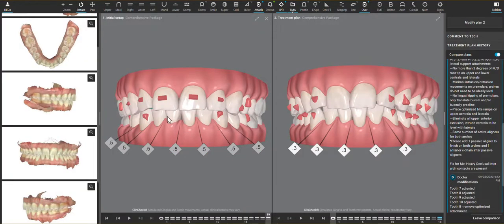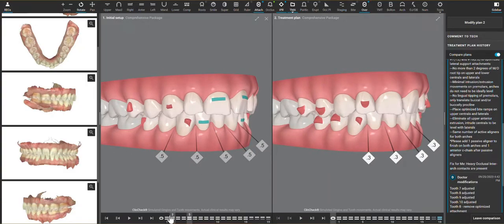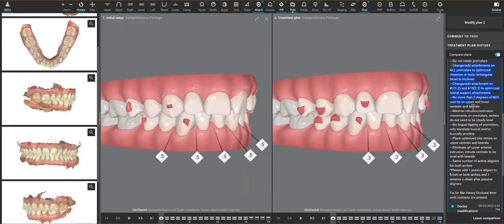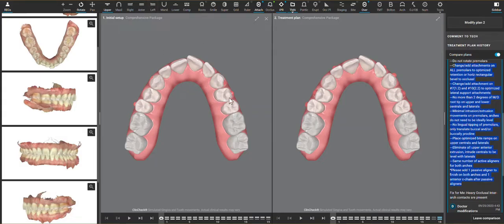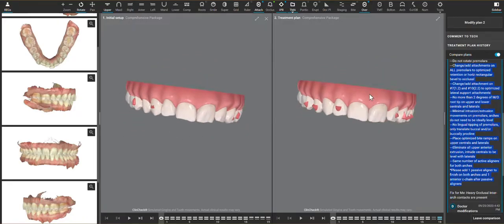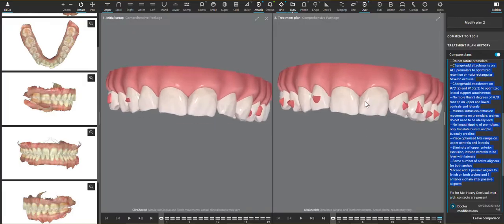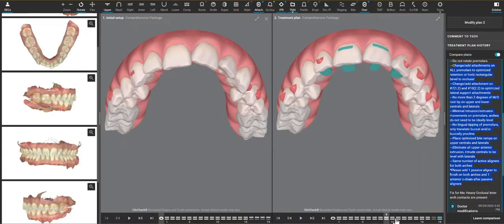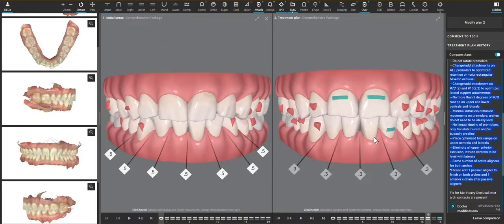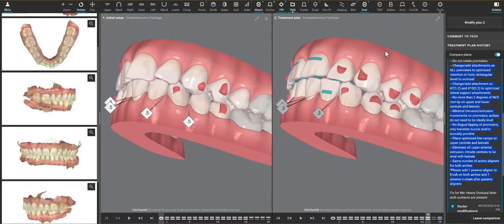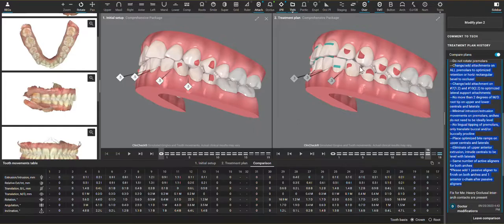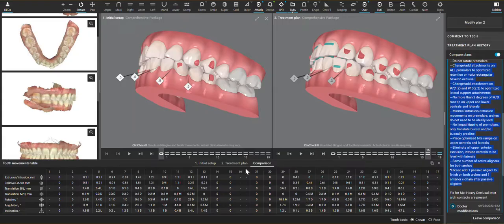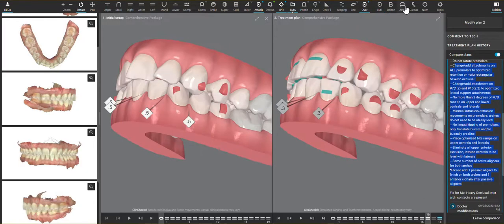Going back to this other deep bite case, but it has upper and lower crowding, I made a lot of the same comments where I look back and I think these premolars don't really need to rotate. We could rotate this premolar if we need to reduce the overjet and take less space in the arch, but considering that this patient has had so much traumatic occlusion and getting these anterior teeth rotated and establishing some better overjet, that is a much bigger objective than rotating the premolar. As adults, we want to treat them realistically rather than if this patient was 10 years old, then we wouldn't think twice about doing rotation there.